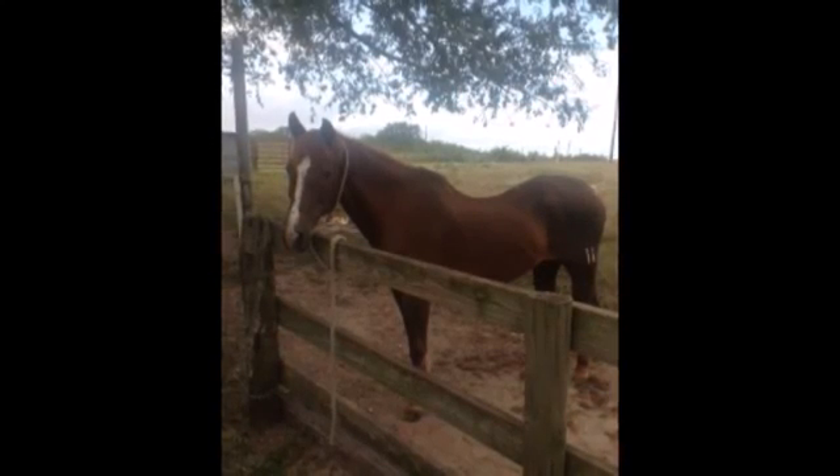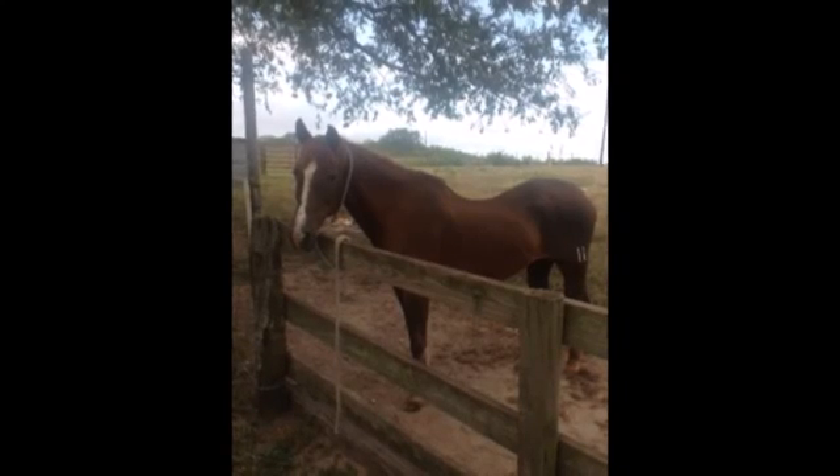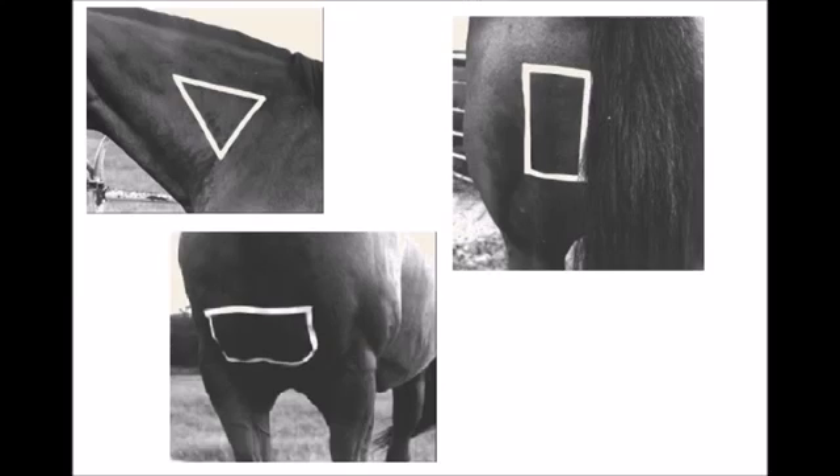If you are unsure how your horse may react to the injection, it is best to untie the horse and hold its lead rope, or have a helper hold the rope for you. A tied horse that overreacts to an injection may pull back on the rope, potentially injuring itself. The base of the horse's neck is the ideal injection site because it allows the handler to remain in a safer area by the horse's shoulders. To locate the appropriate injection area, put the heel of your hand on the base of the horse's neck where it joins the shoulder, about midway between the crest and the bottom of the neck. The area covered by your palm is the injection site.